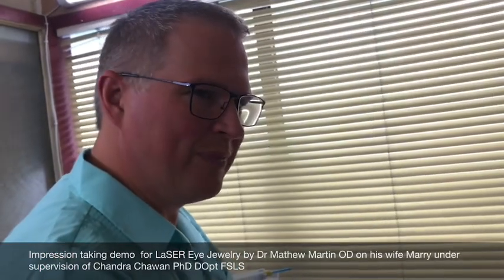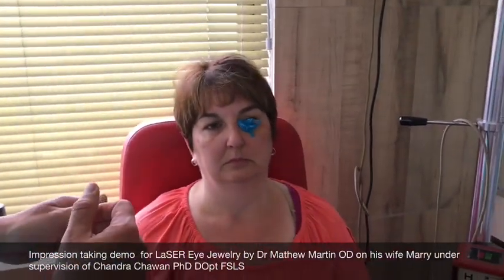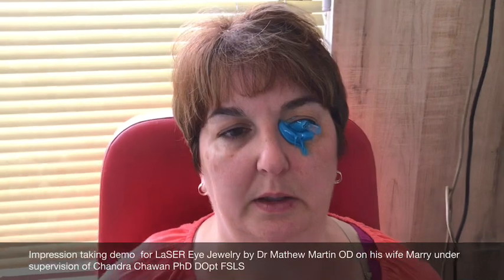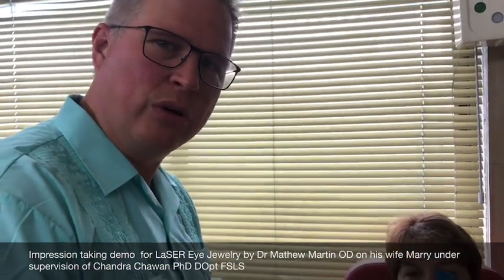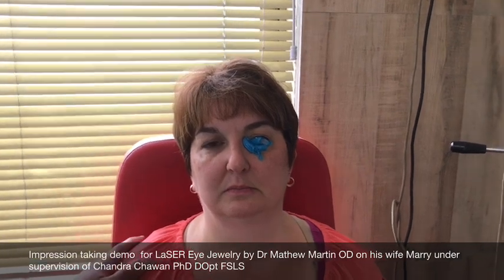The approximate time here again is about a minute, 30 seconds — that looks straight, yeah, perfect. Thank you so much Mary. Chandra's concerned I might have missed it a little bit on the lower lid, but hopefully we've got what we need there. Are you feeling any pain or burning or any weird thing? — No. You're comfortable? — Yeah. Anything weird other than having to look at my face up here? — No, it looks safe. We're in Mumbai at Chandra's clinic, and we're working on making scleral lenses from an actual impression technique, which is fantastic technology. It does such an amazing job — they come out so accurate.